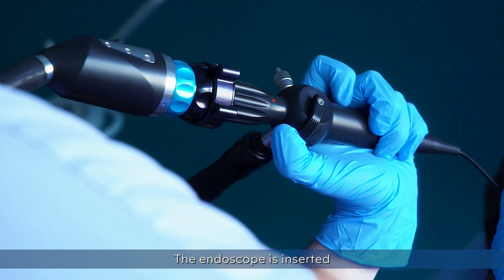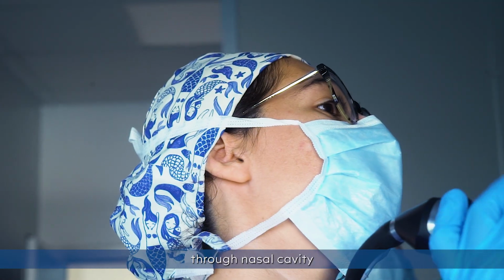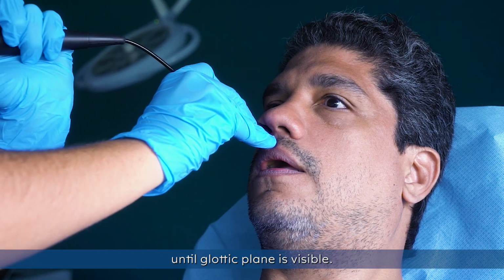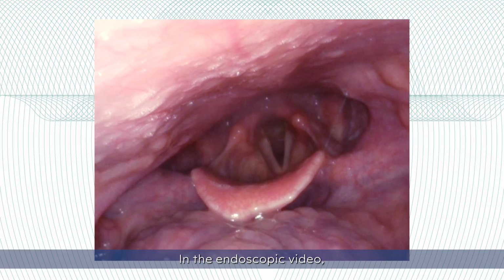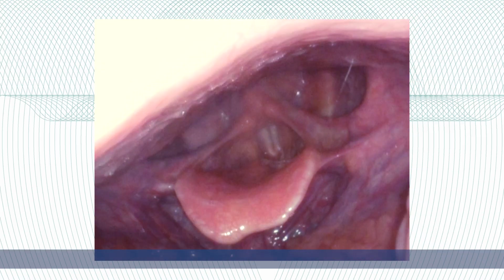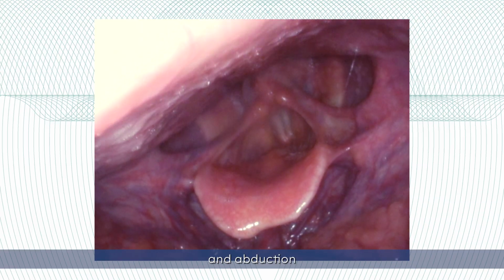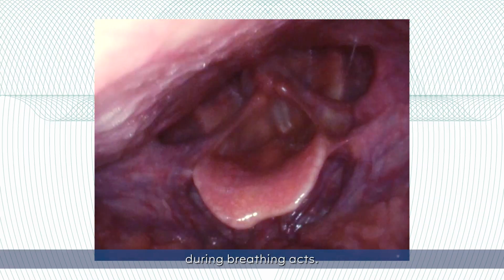The endoscope is inserted in a nostril and progressed through nasal cavity and pharynx until glottic plane is visible. In the endoscopic video, normal laryngeal movements can be observed with vocal cord adduction during phonation and abduction during breathing.